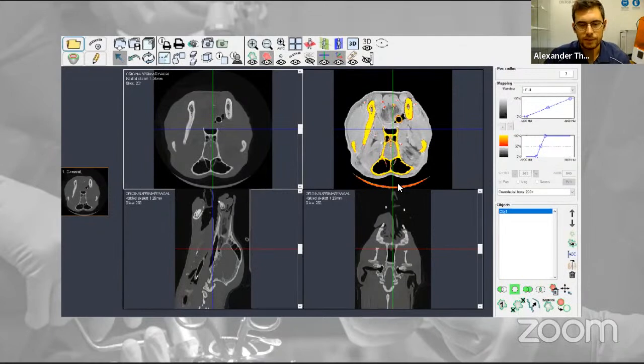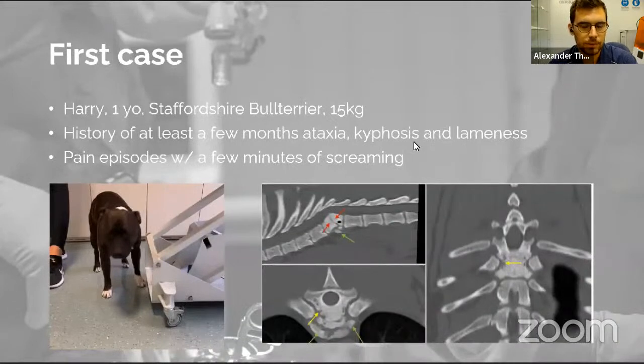And on the top right corner, you can see that with the threshold we choose to segment bones, this software calculates where the bone should be. This is used in every single slice, and then in all reconstructed images too. We get the segmentation to have our models. So that's the basics of creating models in the medical field from anatomical structures.